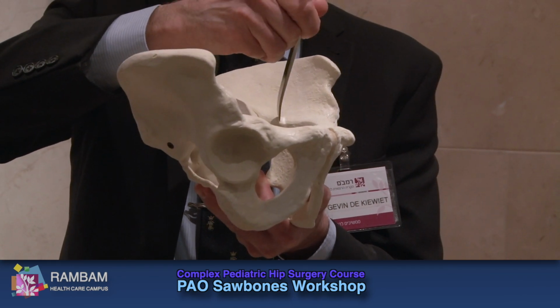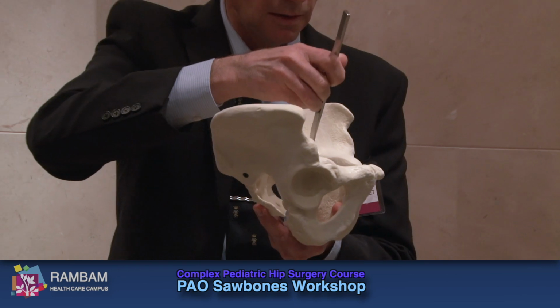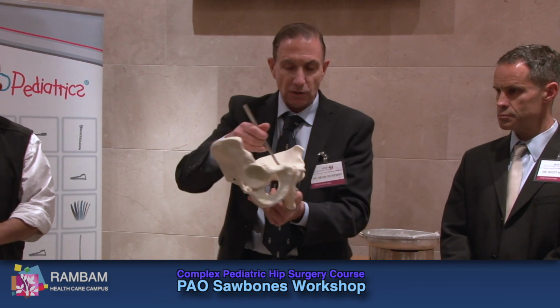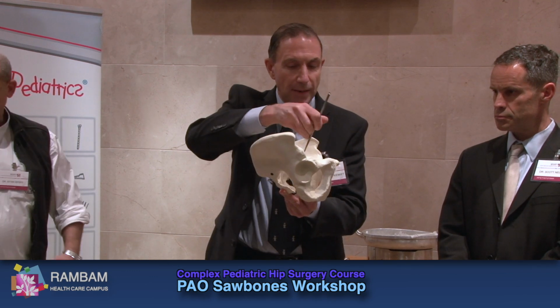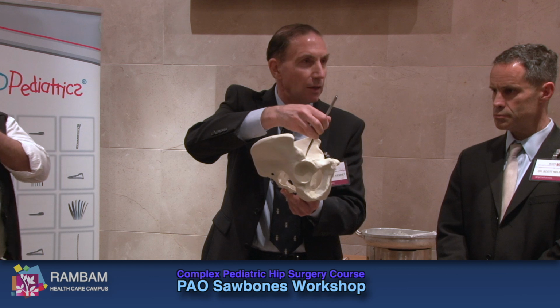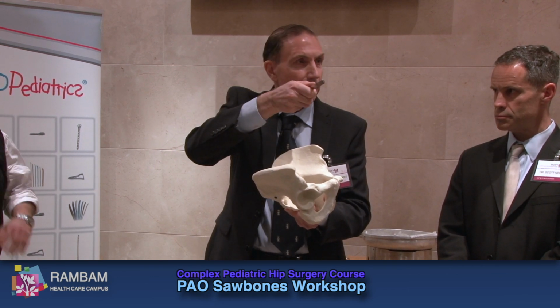If I put this osteotome perpendicular to the face of this bone, you can try it, perpendicular, it will come out exactly at the right spot posteriorly. As long as the osteotome is not doing that, or doing that, but I'm absolutely perpendicular to that face of the pelvic bone, it will come out in the right spot posteriorly. And you know you've got that cut, and the angle cut is done.